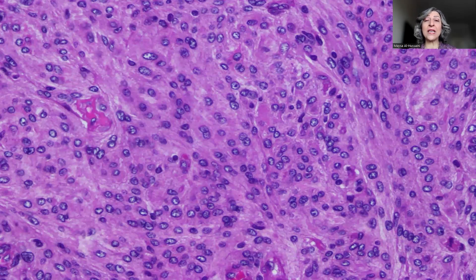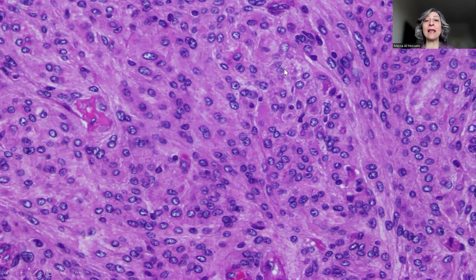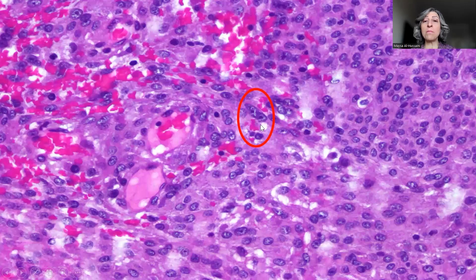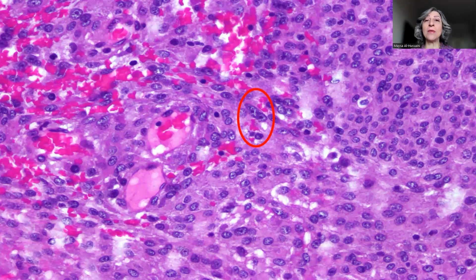So now we have spontaneous necrosis and we have the sheet growth pattern, and we started to really suspect that this might be an atypical meningioma. What we also started to see is a prominent nucleolus in the meningioma cells. In addition to the sheet growth pattern, we started to notice prominent nucleoli. Remember, prominent nucleoli is another feature of atypical meningioma.